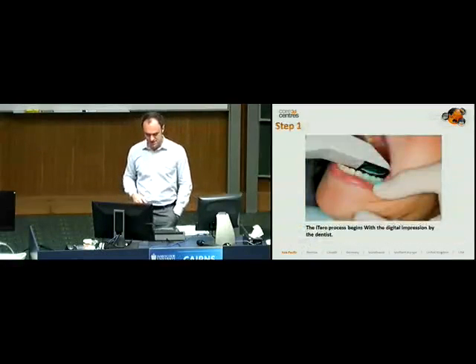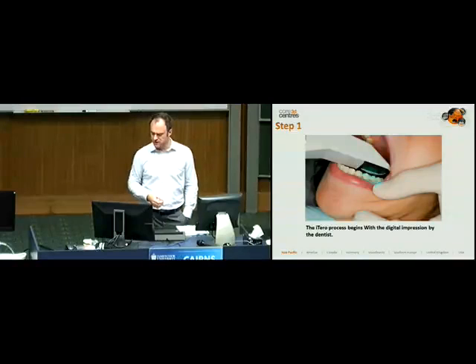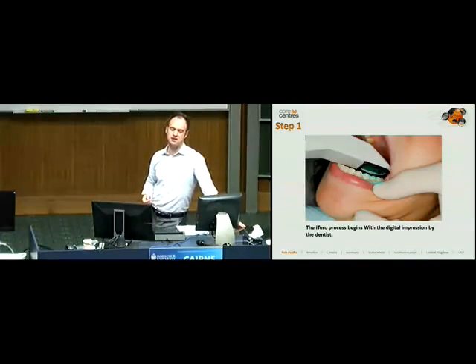So the first thing that happens is that the dentist or the orthodontist takes the scan. Now, the parallel confocal scanners tend to be a little larger than something you've perhaps seen with Sirona or E4D. I suppose the easiest analogy to make is it's like an SLR camera. SLR cameras haven't got very much smaller because they need a lot of light to get a good picture, and the sensors also need to be quite large. It's the same with parallel confocal technology. The aperture needs to be very big, and because the light source or the lenses move, the handle, if you like, we call it a wand, needs to be quite big to contain those.